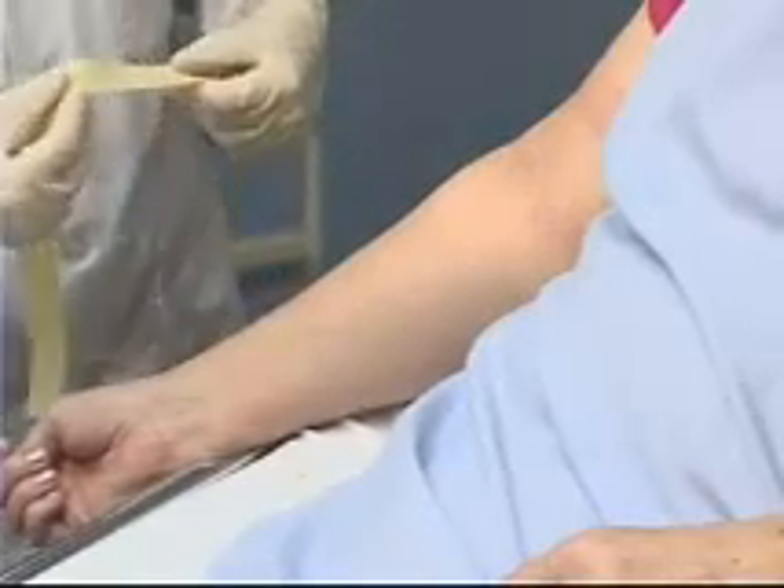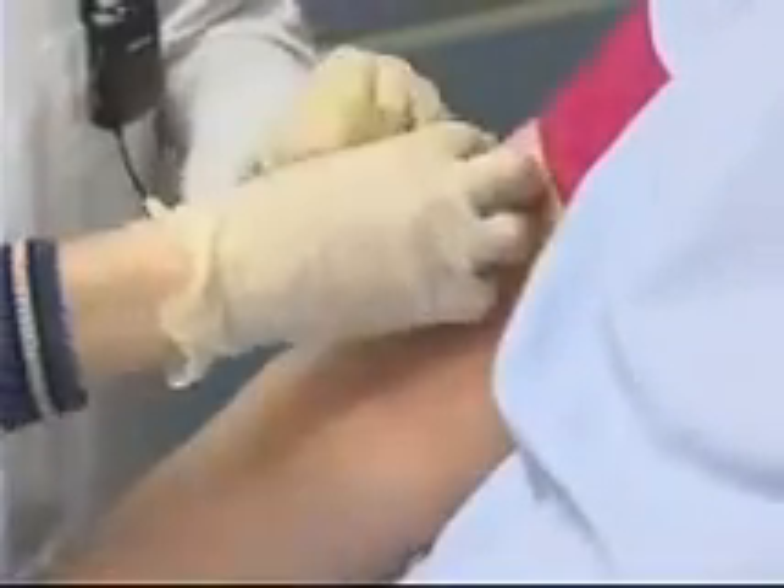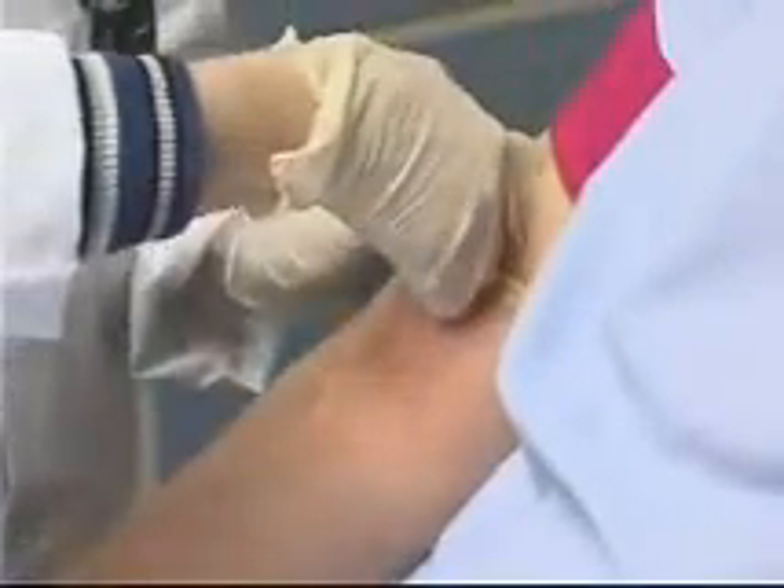The site I've chosen is the antecubital, so I'm going to apply the tourniquet to the arm approximately three inches above the antecubital fossa, and I'll put that on like so.